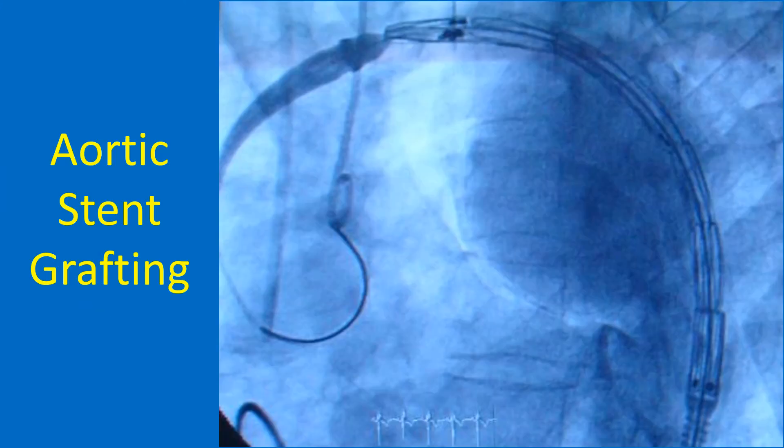This fluoroscopic image shows the aortic stent graft positioned in the arch and descending thoracic aorta, ready for deployment. The saccular aortic aneurysm is also visible in the background. While positioning the device, shortening during expansion should also be taken into consideration.